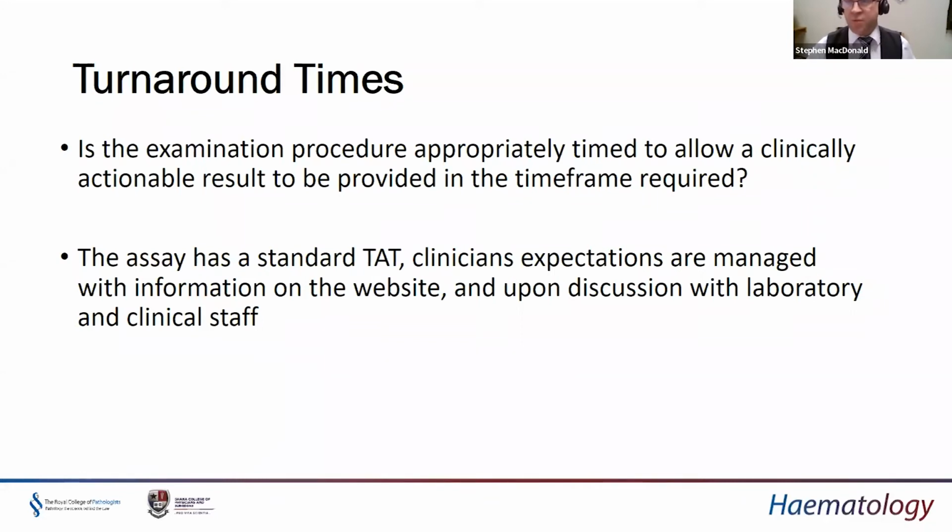and the urgent samples prioritized. Again, a simple example of that would be if we have 2,000 community samples that are running through, and then suddenly we get an urgent sample from an emergency department. If we're not able to run the emergency sample through because everything's held up because of the high volume samples, we're not providing a quality clinical service to those in most need of the clinical service at that given time.